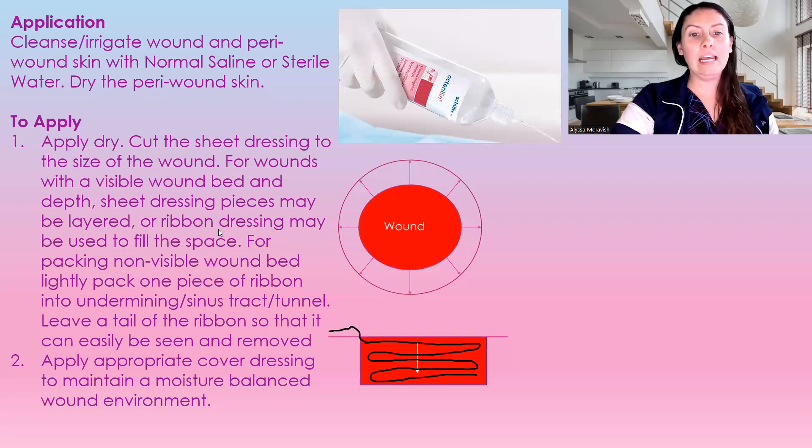It can be cut. Layer the ribbon down inside of the wound, as I've shown here. Always make sure that there is a tail. If the wound base is not visible or it's hard to see, make sure you're only using one piece inside of that wound. Layer it back and forth, because you do not want to lose this inside a wound. Always make sure there's a ribbon outside of the wound so it can be easily removed — especially when there's undermining, sinus tracks, or tunnels. You need to make sure you are leaving a tail.